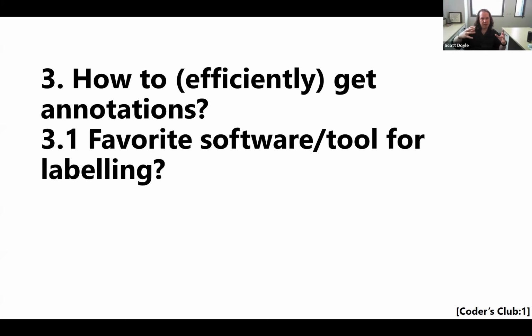Because you have hard annotations, you have soft annotations with hard boundaries and soft boundaries. You have ontological definitions of, this is a cell, this is where the boundary of the cell is. So you have the right annotation versus a fuzzy annotation or a weak annotation. That's all part of the conversation. I would hesitate to say that an annotation was done wrong. I think instead an annotation instruction may have been interpreted by someone differently. So the language that you use to describe this becomes part of the pipeline and part of the experiment.